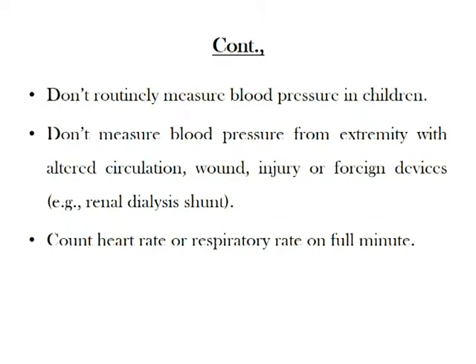Don't routinely measure blood pressure in children. Don't measure blood pressure from an extremity with altered circulation, wound, injury, or foreign devices, such as a renal dialysis shunt. Count heart rate and respiratory rate for a full minute.